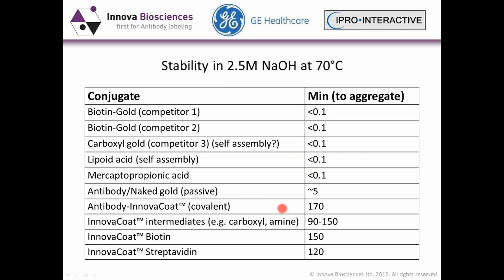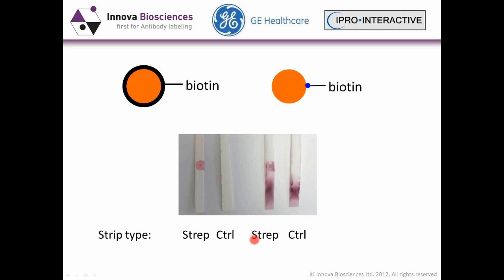With the Innova coat, we're seeing nearly 2 hours, 3 hours, depending on the stage at which that particle is, whether it's coated and what it's actually conjugated to. So the significant increase in the stability of that colloid.